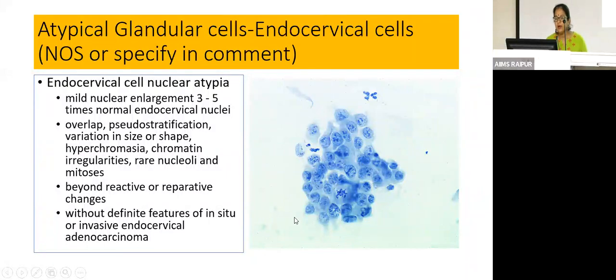Okay. Now, what are the other things? On the lower spectrum, it should be more than the size of a reactive nucleus, and on the other extreme, there should be no definite features of adenocarcinoma in situ or invasive adenocarcinoma. All right.